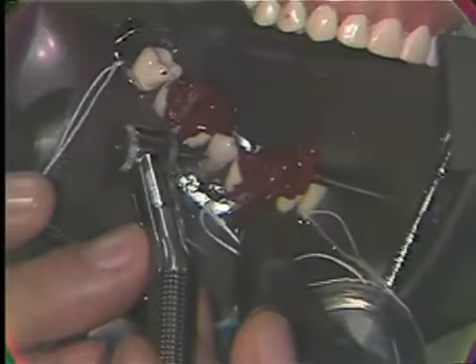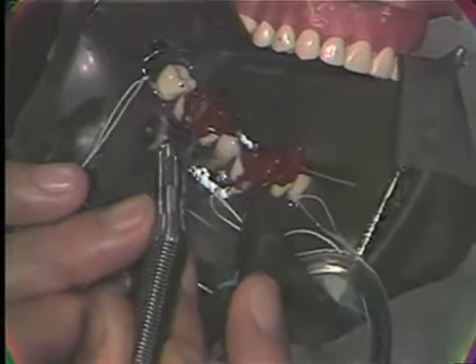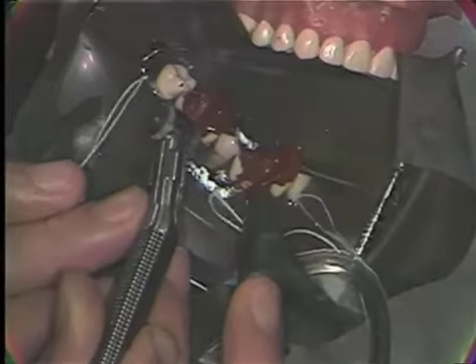You'll note the angle that I am holding the bur, trying to meet the cavo surface at right angles to give the dentin full support. And as I go to the occlusal, I will tip my bur, give full taper to the wall.